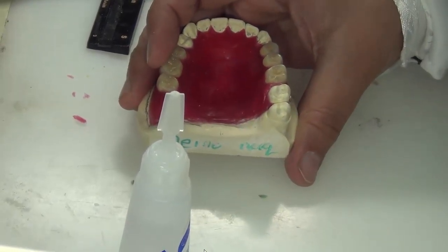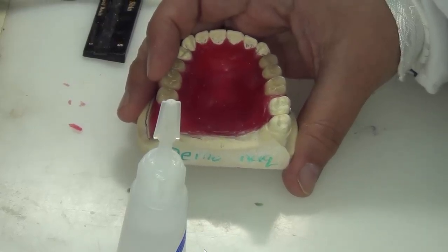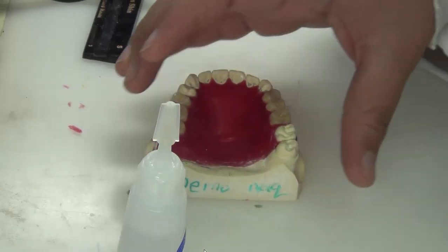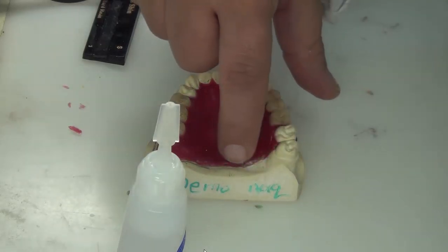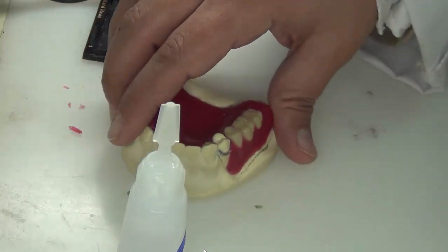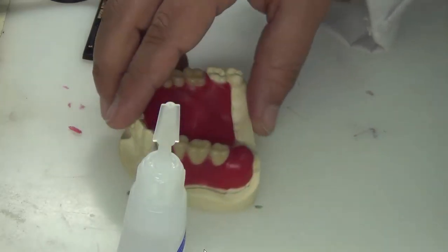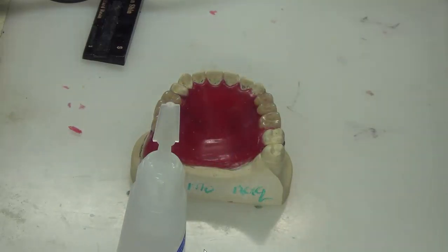It's similar to the sealing step that we have done in dentures, but remember, why did we seal in dentures? Because we had a base plate. Here we don't have a base plate. We immediately put the wax on the stone. So we just need to make sure that it's sealed all around the location, all around the teeth, and that it has smooth and clear finish lines, okay? So that all of the lines are clearly in uniform thickness at all edges, okay? So this is correctly sealed.